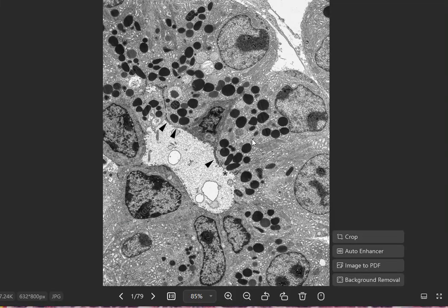So if you look at this EM picture, this is a pancreatic acinus here. Pick one cell, and you can see the nucleus is basally located, and this is the rough endoplasmic reticulum. It's crammed everywhere. And you can see some mitochondria as well, a little bit elongated. There's a mitochondria there, and that's a mitochondria. This could be a mitochondria as well.